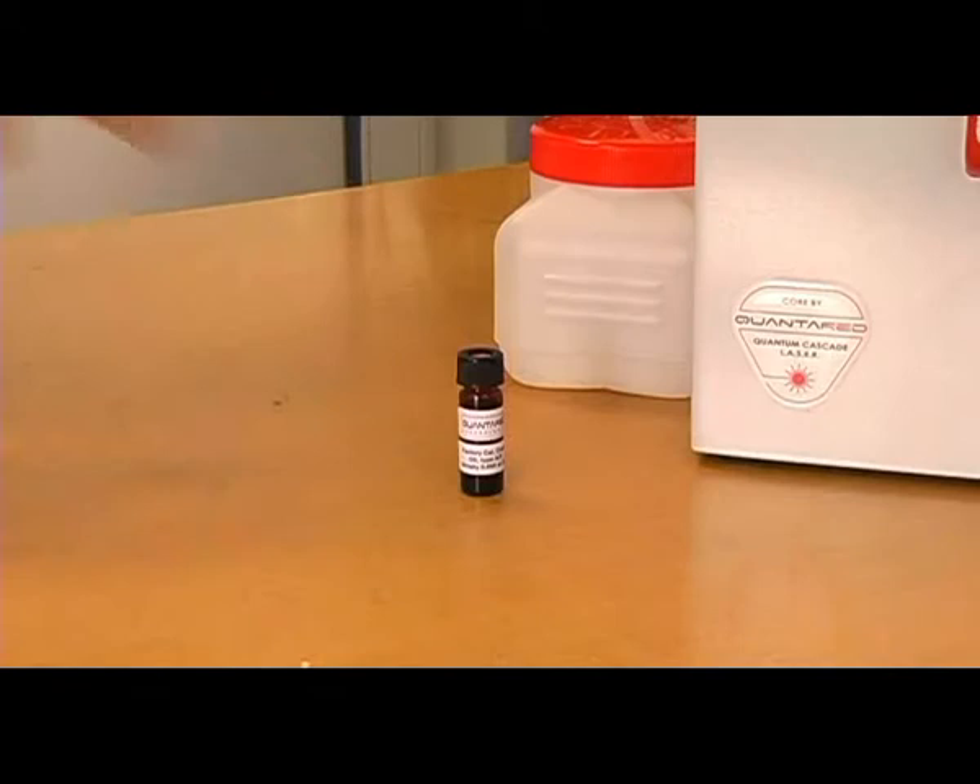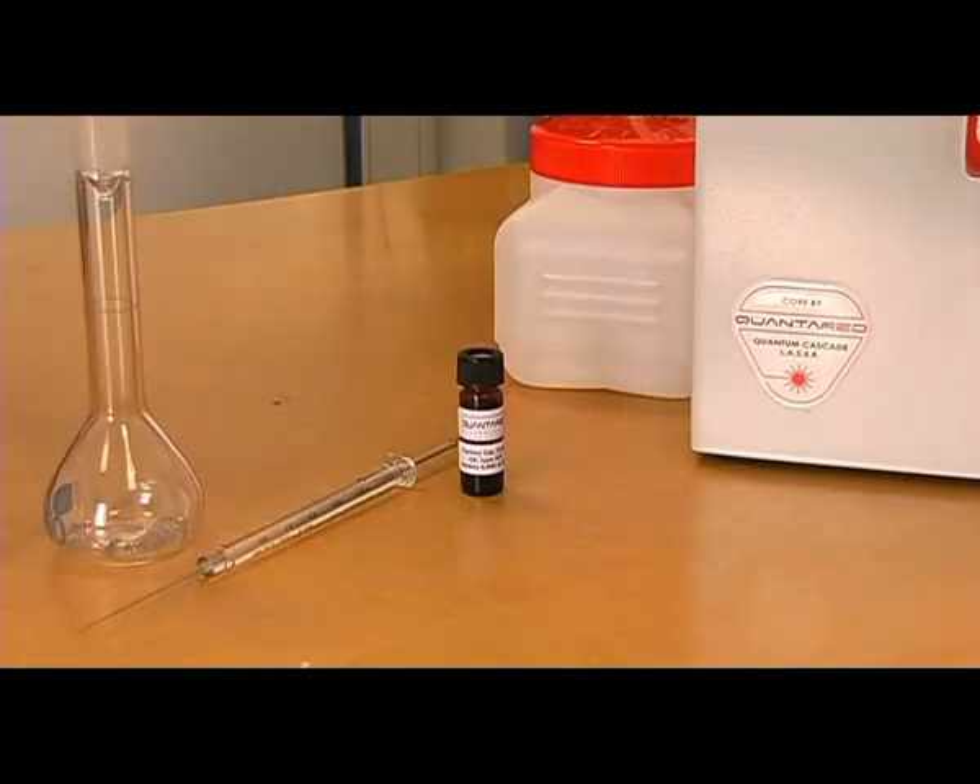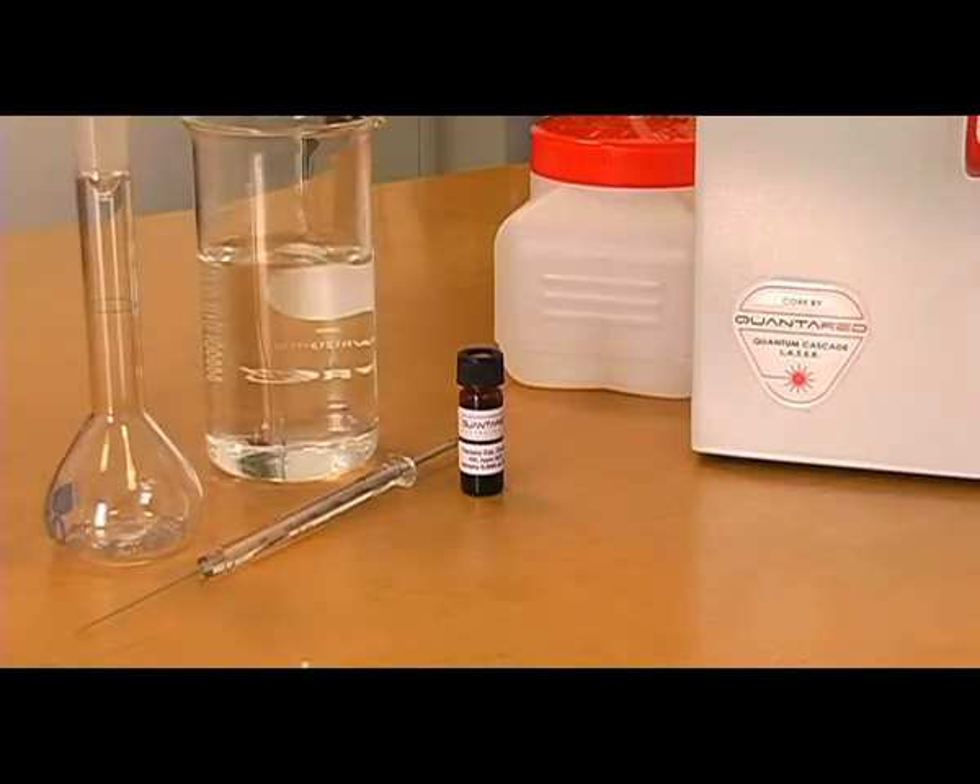Included in delivery are a bottle of crude oil, a microsyringe, and a volumetric flask with glass stopper. Prepare at least 100 milliliters of cyclohexane with purity better than 99.5%. Be sure to use glassware and no plastics other than PTFE to come in contact with the solvent.